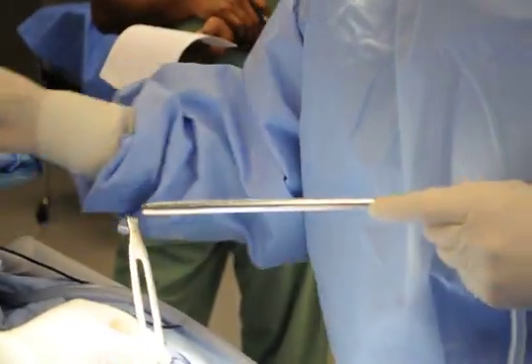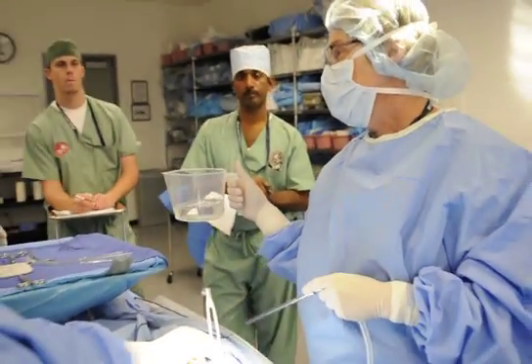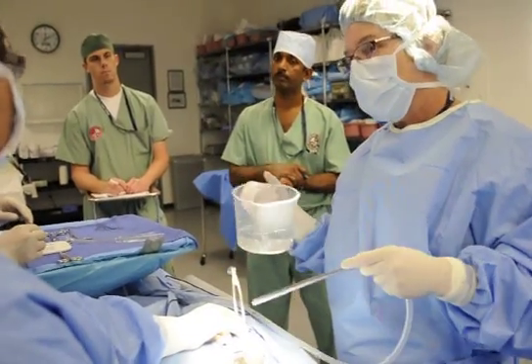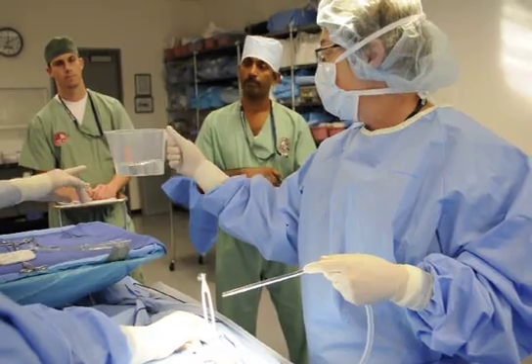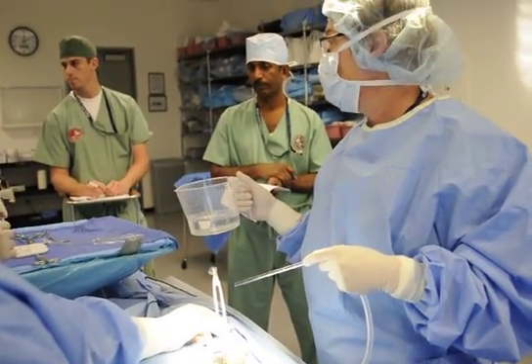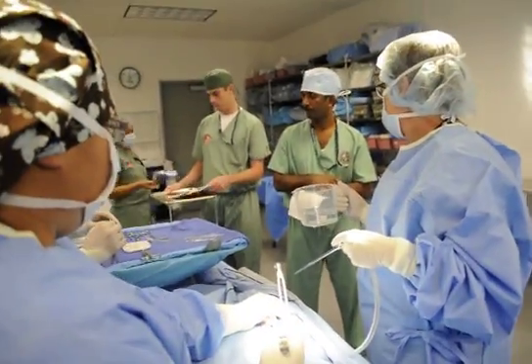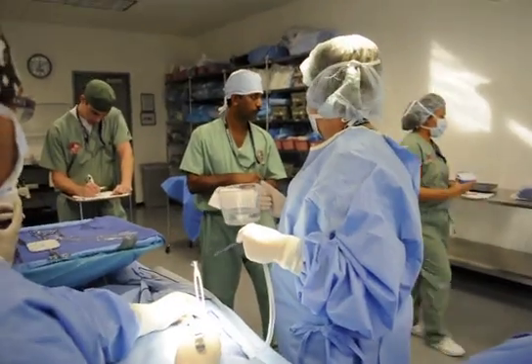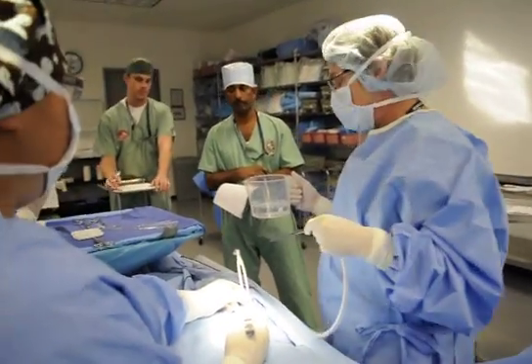If this was a two to three hour appendectomy, this water's cold — do we want to pour cold water? No. So you'd have to get warm water. Now you've got to get those instruments separated out so we can count them. You either get a mayo stand and put a towel down over it, or something, and separate those out. Where did the sponges go? In the kick bucket.